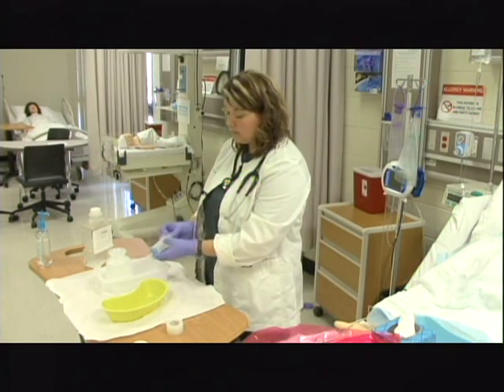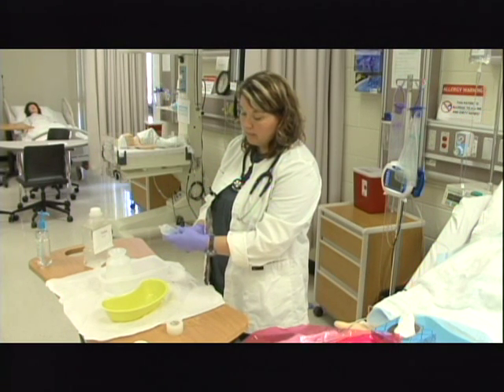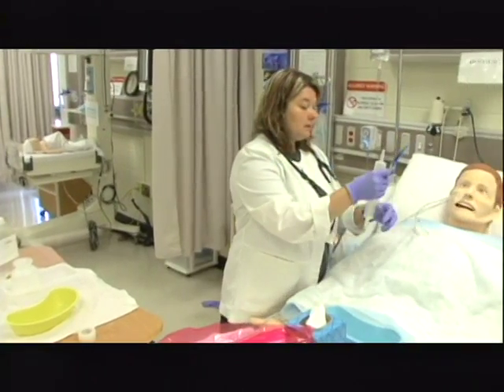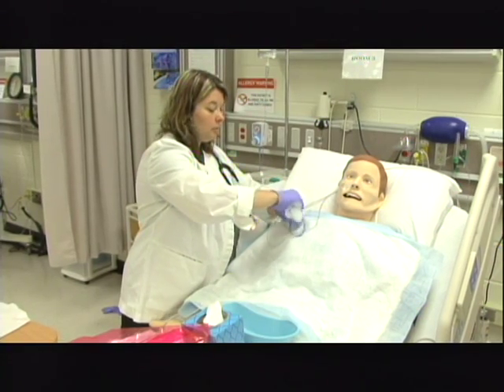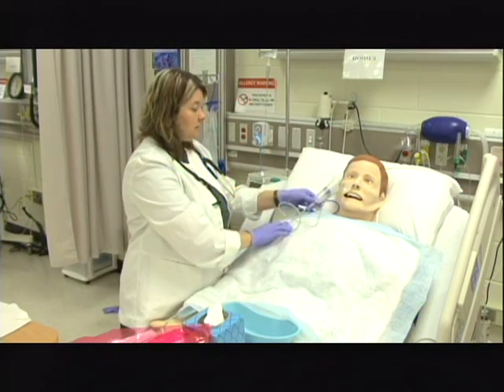So what I'm going to do is pull between 30 and 50 milliliters of air up in my piston irrigation syringe. I'm now going to come over here and again clamp the tube because I have already confirmed placement. I'm almost ready to pull the tube out. Take the anti-reflux valve out and attach the syringe.